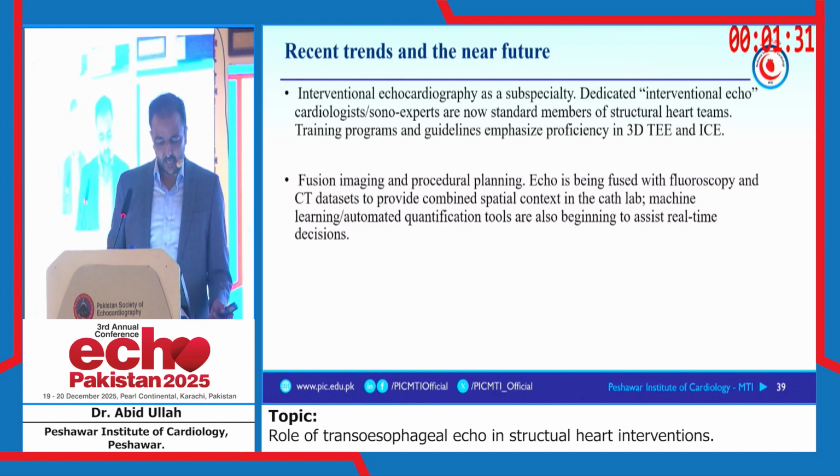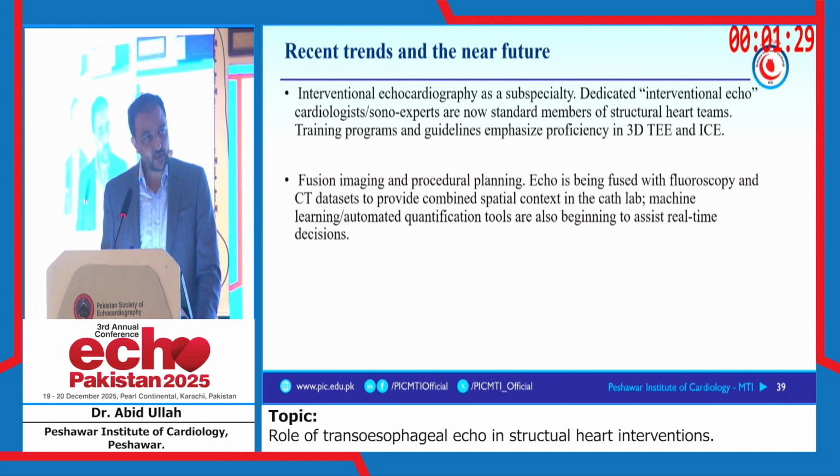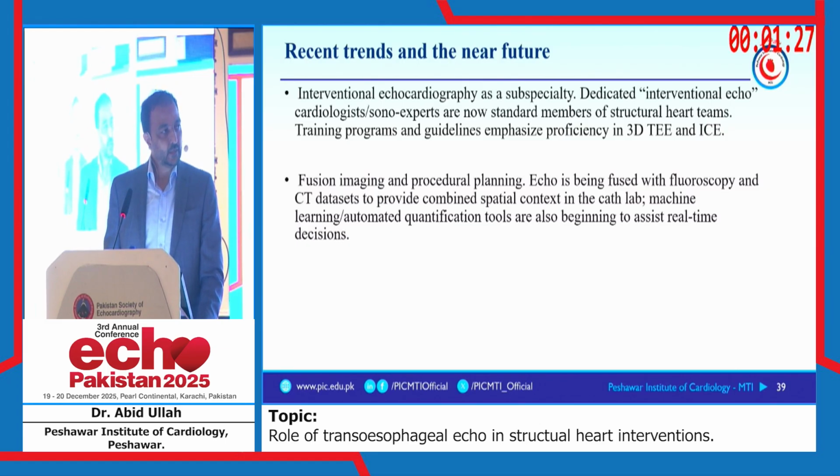I would like to say that the near future is going to be interventional echocardiography. They are an essential part of the structural heart intervention team now. There are guidelines on that. There are training programs. And I think any of the budding echo or the imaging cardiologists should follow these paths. The future also lies in the fusion imaging with the fluoroscopy, with the CT data set. This is going to be the future.